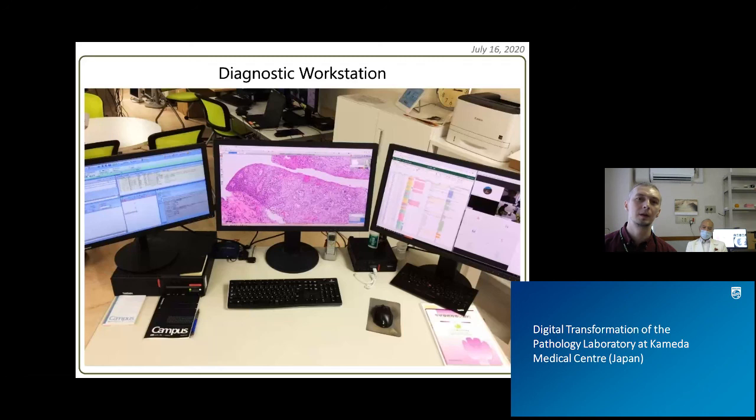And if your image quality, if your scanner quality is good, you really don't need glass slides anymore, because you have many handy tools, particularly annotations and more on top, which you miss a lot when you're dealing with glass slides. So that's the answer. It's a short time, just a couple of minutes to get familiar with that.